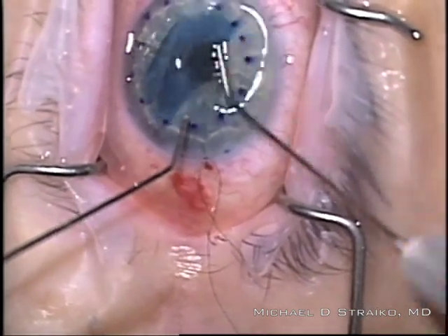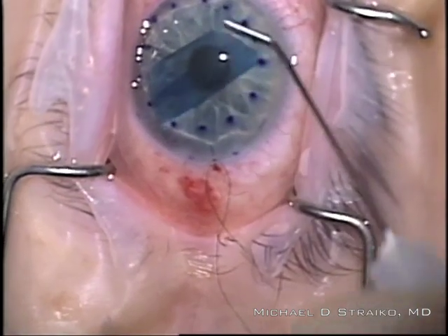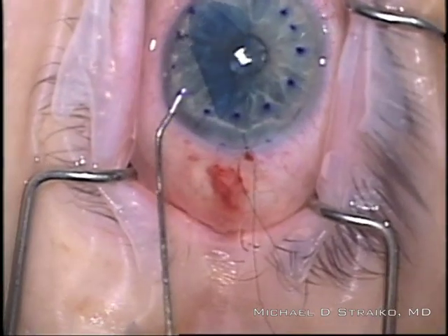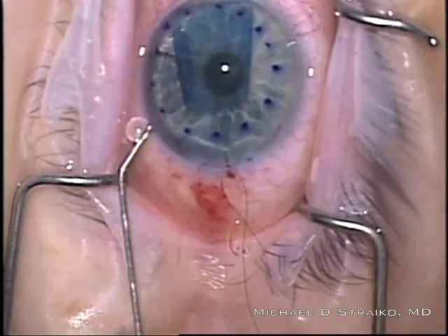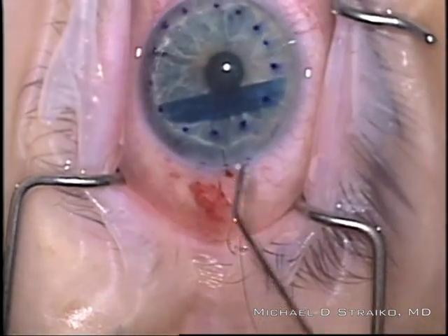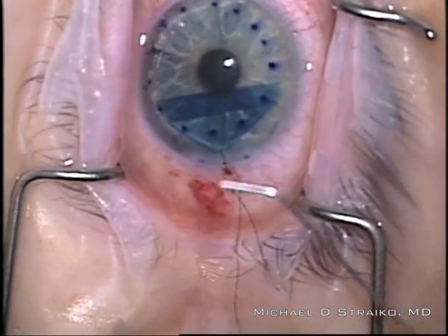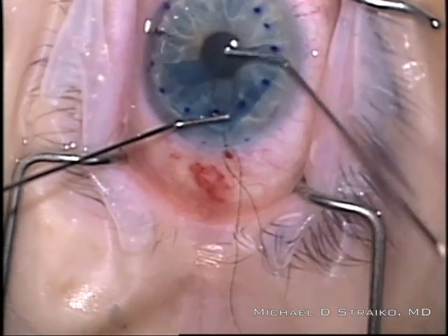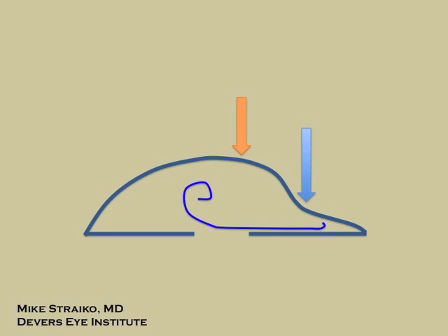Now I'm starting the DMEK unfolding dance. Every graft and every anterior segment can behave a little differently. I'm tapping but it's kind of 50-50, so it's hard to open, so I give it some bursts of BSS along the iris to help unfold it. I can see it's upside down — the S-stamp on the edge confirms that — so I roll the graft over and let a little fluid egress out to let that flap open up temporally. Now I'm going to apply some pressure over the temporal aspect of the graft — not pinning it, not smashing it — but tapping the rest of it out.